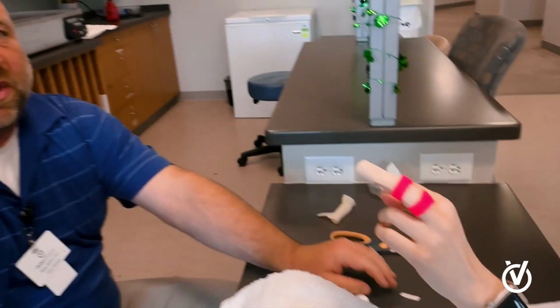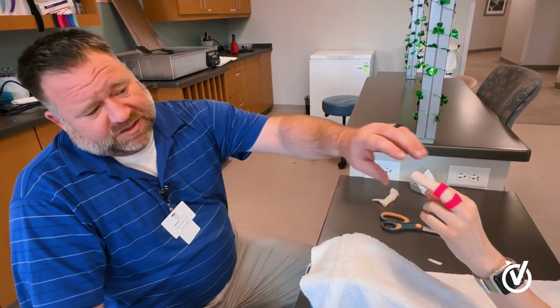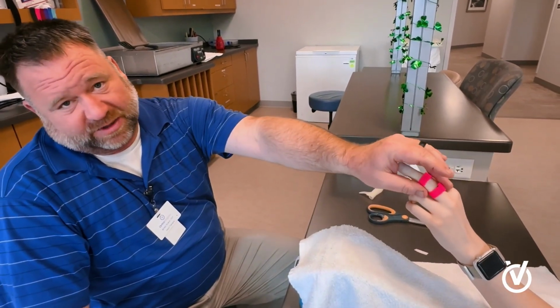I encourage them to wear this full time. It is very hard to take it on and off without DIP flexion, so I encourage them to bag up their hand with showering and wear it full time. Typically, we'll have them wear this for 2 weeks. We'll bring them back in, take it off.